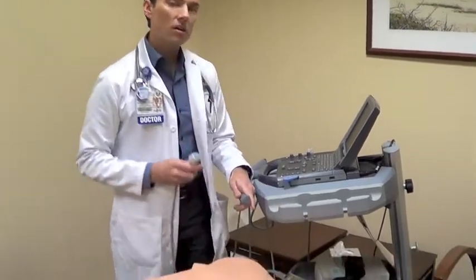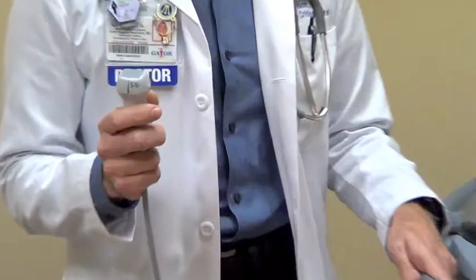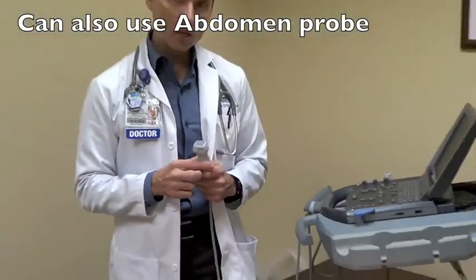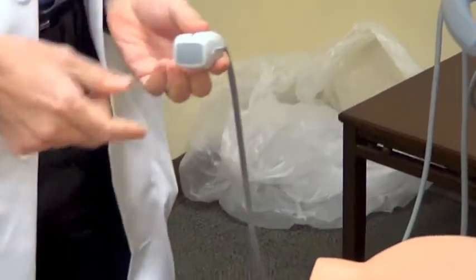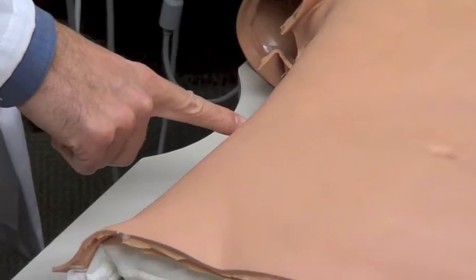I'm going to use my cardiac probe in order to visualize a pleural effusion. The first thing I'm going to do is make sure that the cardiac probe marker is oriented cephalad. Then I'm going to go to the mid-axillary line on the side where I suspect the effusion.